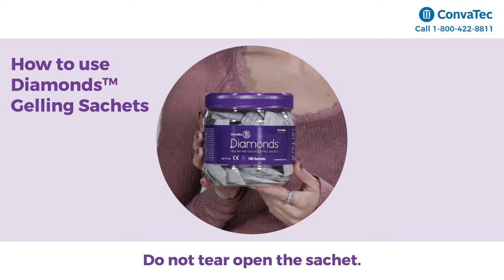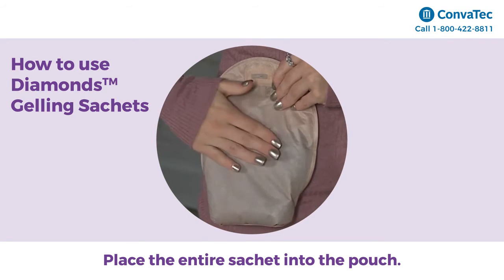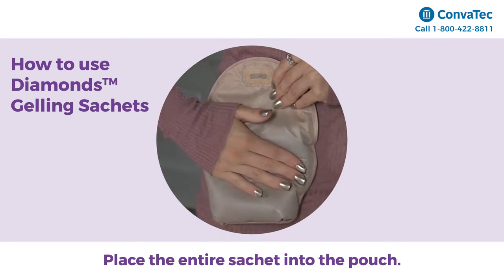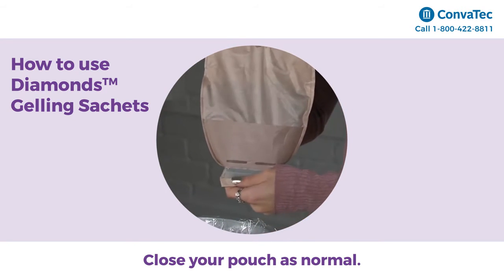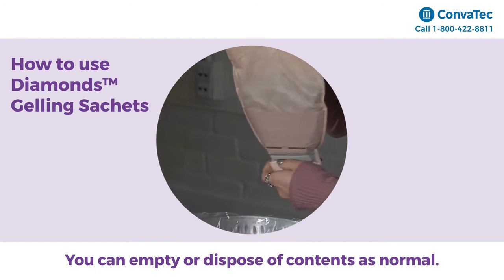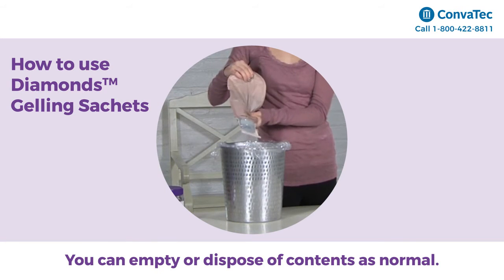To use, do not tear open the sachet. Place the entire sachet into the pouch through the wafer hole, the flange opening, or through the drainable pouch outlet. Close your pouch as normal. When it is time to empty or dispose of pouch contents, you can empty or dispose of contents as normal.